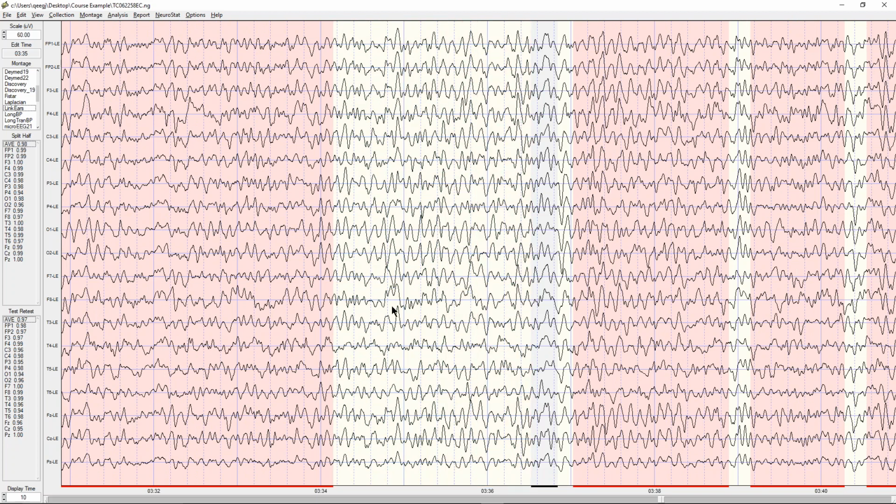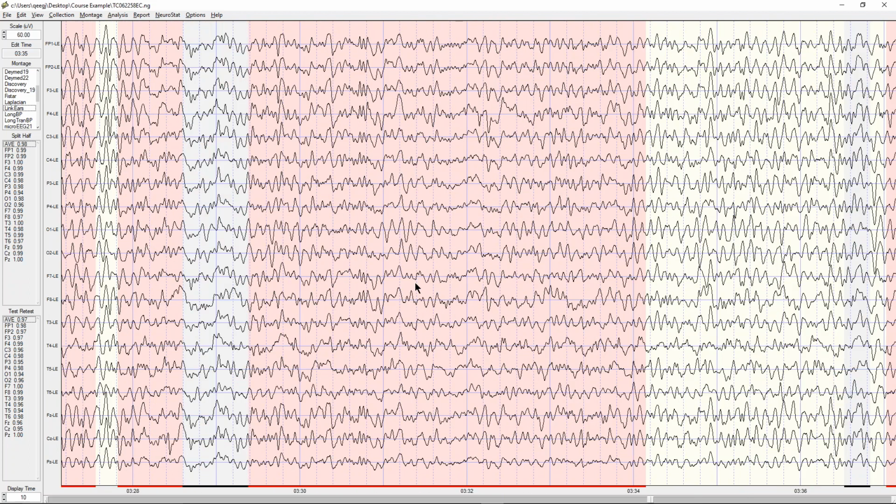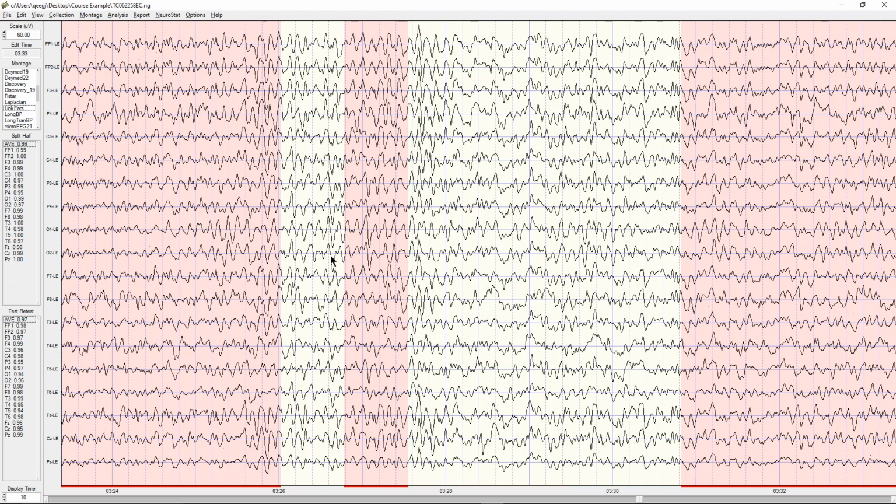And so I'm seeing this right here. It's very likely not problematic, but there is a little saying in electroencephalography: when in doubt, throw it out. But this is clearly some sort of a movement artifact, or because this is at T4, there's some kind of a drifting movement artifact here. It's at T3 as well. It's also at F8. It may be coming back from the lateral frontal sensors. It may be a lateral eye movement artifact that reaches back all the way to the temporal electrodes.